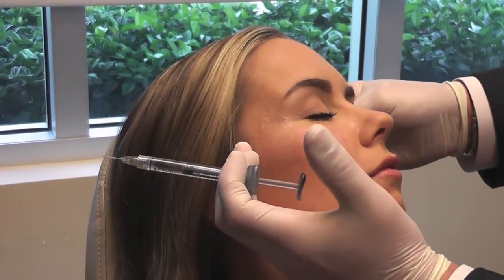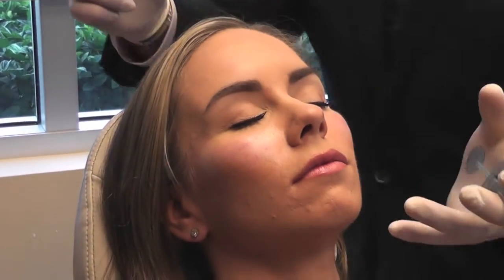All right, turn toward me. Okay, back. Now we're going to concentrate in this submalar area here, which contributes to sort of the apple of the cheek. It's also important to note that you don't have to complete one side before you move to the next. You could allow the lidocaine that's loaded into the Voluma to work, move to the right hand side, and then come back to this side after that lidocaine has allowed for adequate anesthesia.